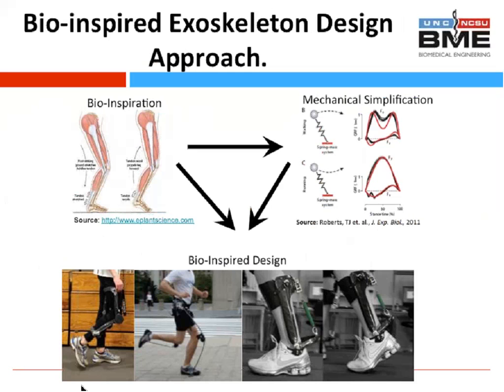And in particular, at the ankle joint and distal joints, you've got long, stretchy tendons that are good for storing and returning energy. And in fact, simple physical models that involve just springs and masses, which you see on the upper right, can explain the center of mass dynamics and actually produce ground reaction forces that are measured experimentally for both walking and running. And so it's our idea, and the idea of many others, which is starting to tack on a bit, that maybe it's a good idea to include springy elements in wearable devices in an attempt to make them lighter, more portable, and potentially more functional.